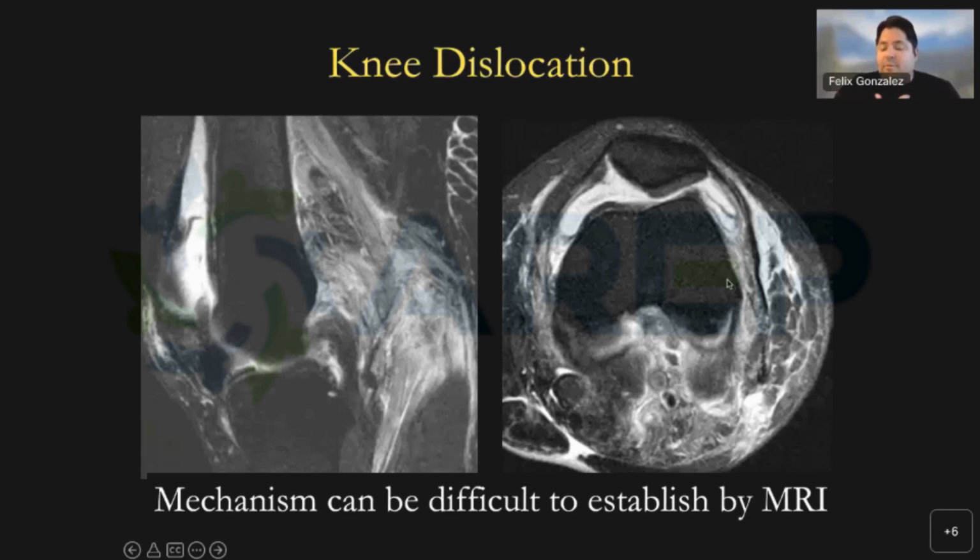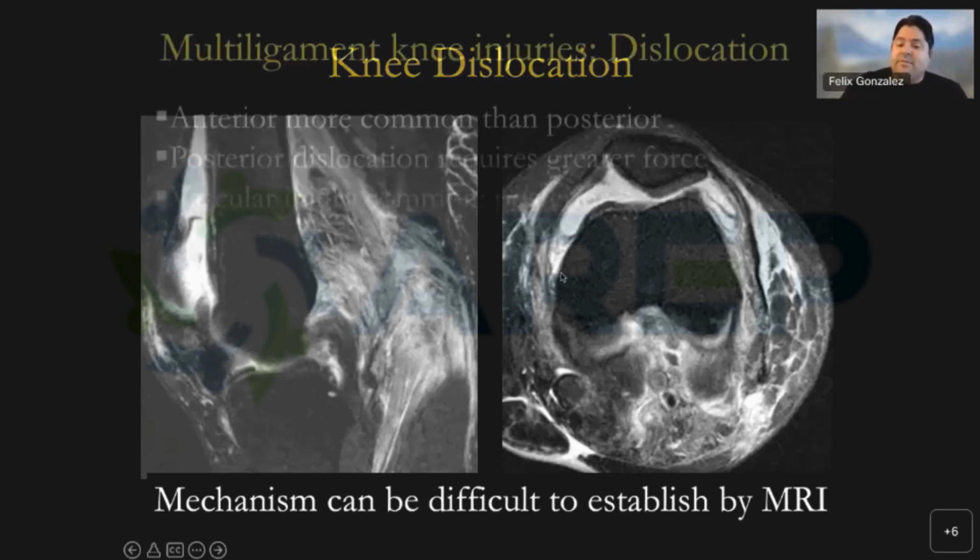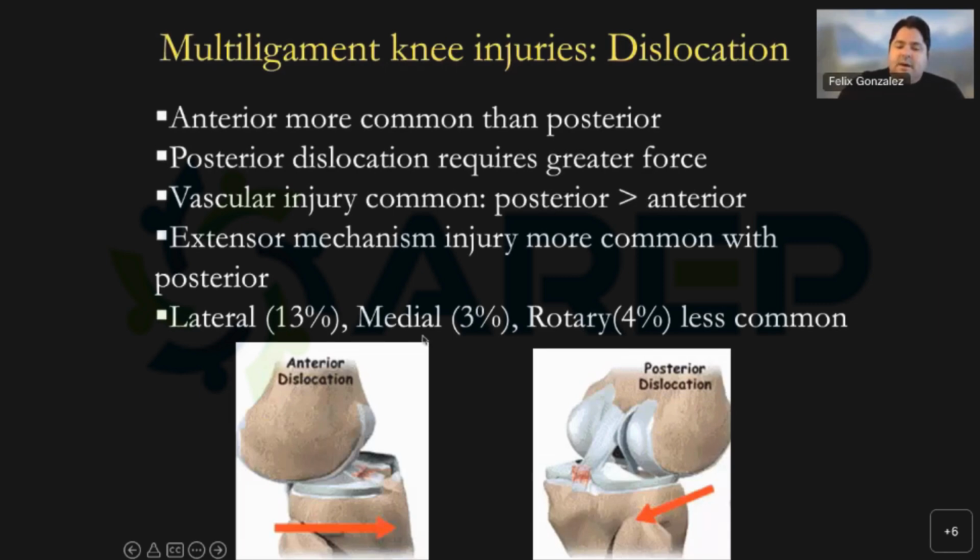And in my report, in the impression, I say medial compartment of the knee demonstrates the following injuries. I say MCL grade 2, and I kind of break it down into different compartments. I say, medial compartment, here are the injuries, lateral compartment, here are the injuries, posterior compartment, here are the injuries, and then let the surgeon decide what sequence he's going to take to repair that knee.